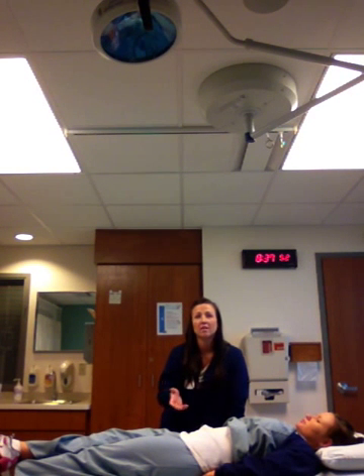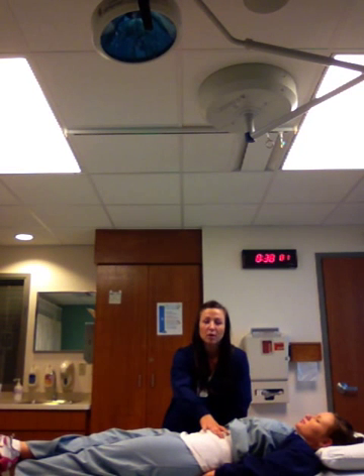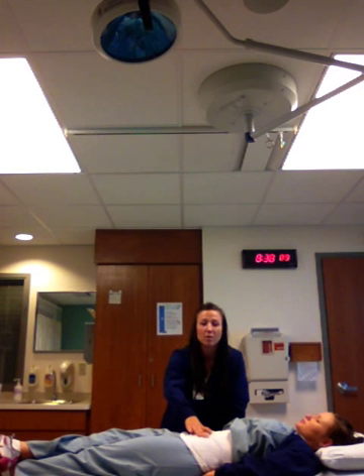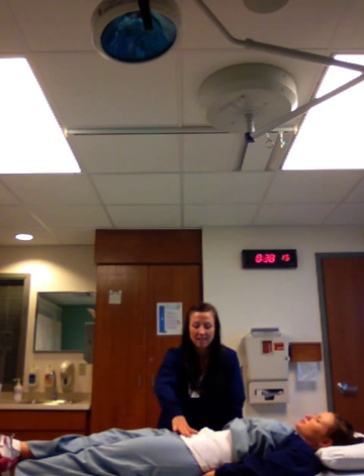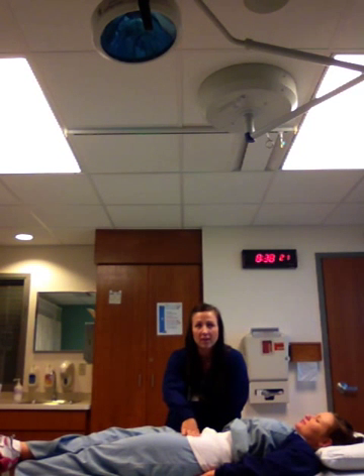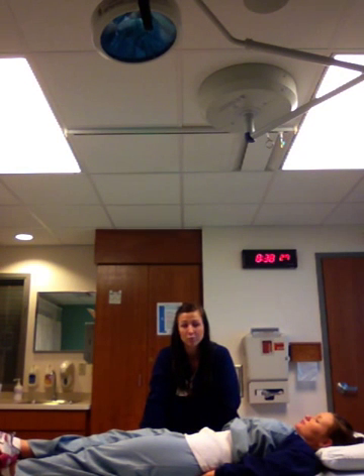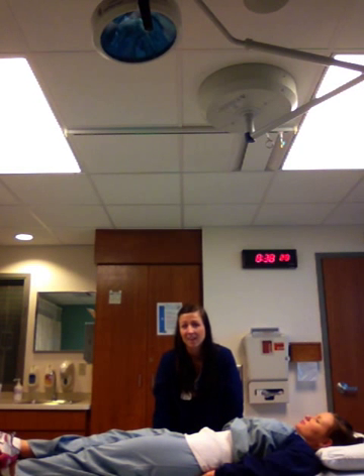Another test that you can perform is listening for vascular sounds, and right above the belly button you're going to listen at the aorta, and then just below that you'll hear the renal, left and right renal vascular sounds, and then just below the belly button are your iliac vascular sounds, right and left, and then down in the pubic area in between the hips are your femoral vascular sounds. And what you're listening for is a bruit. You don't want to hear a bruit, you just want to hear really nothing. That would indicate a normal finding.